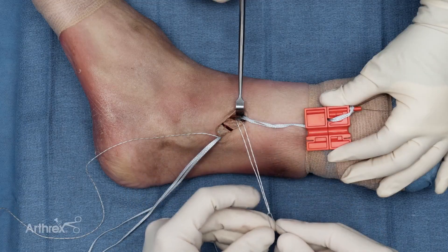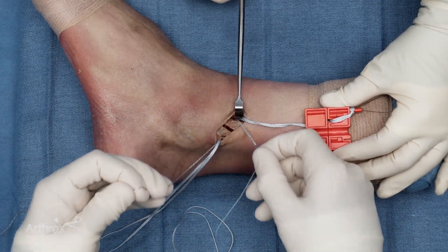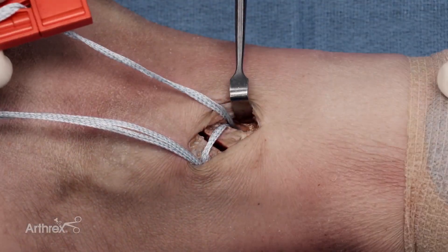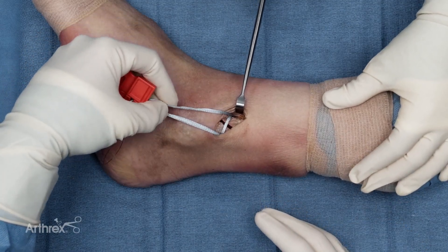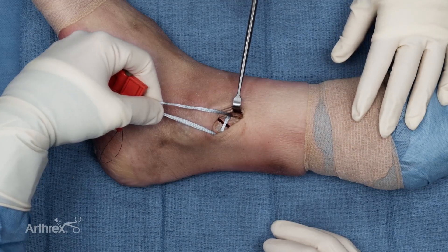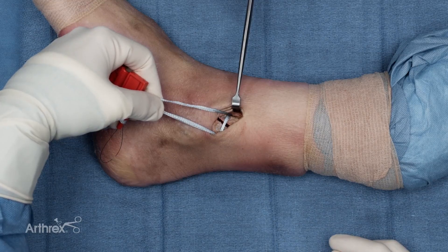To make the second pass of the fiber tape cerclage, I'm now going to load the fiber link, and then by pulling on the other limb of the fiber link, that's going to facilitate the second pass of the cerclage. Now we have both limbs around the fracture site. The next step is to gain your anatomic reduction — move the fiber tape cerclage out of the way briefly, then provide reduction stabilization with the fiber tape cerclage.